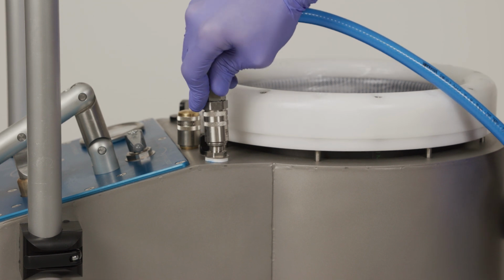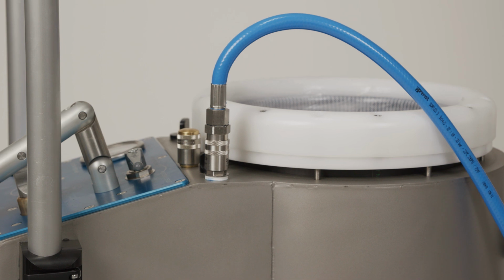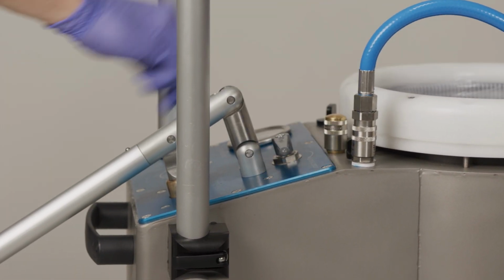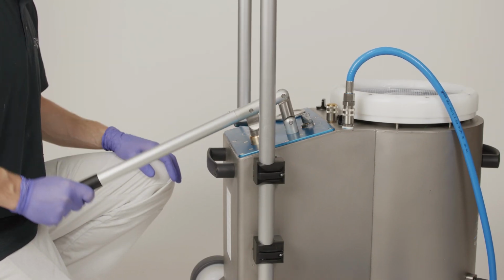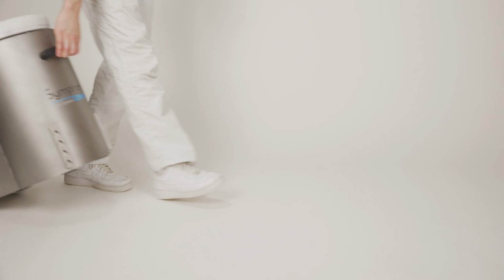We recommend to change the water every week, and the membrane every 9 months. For further information, please refer to the user's manual or contact us at support@romaidis.de.